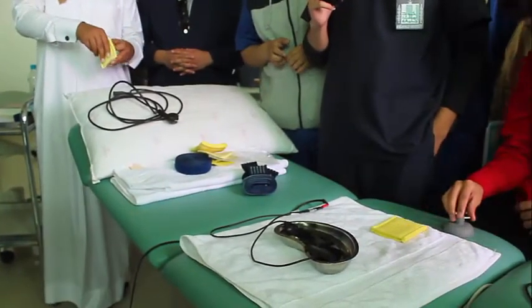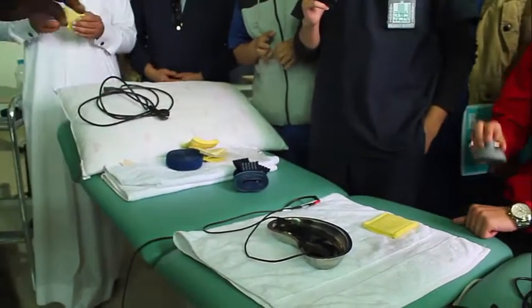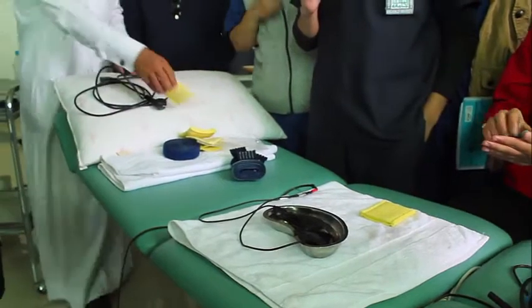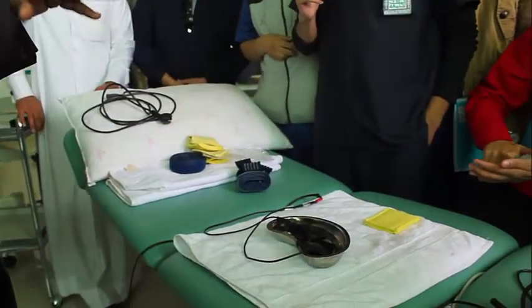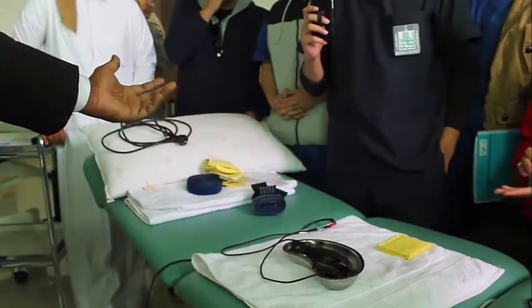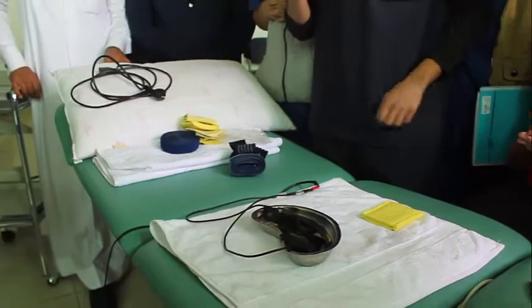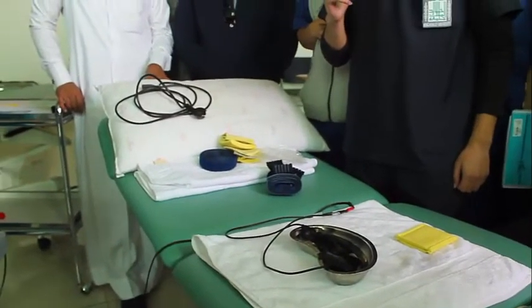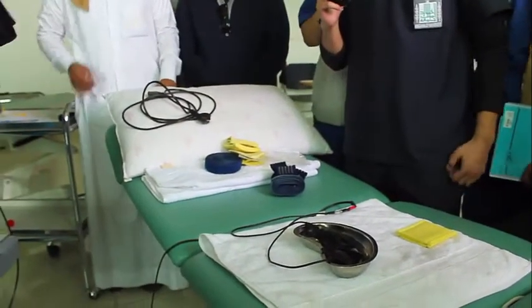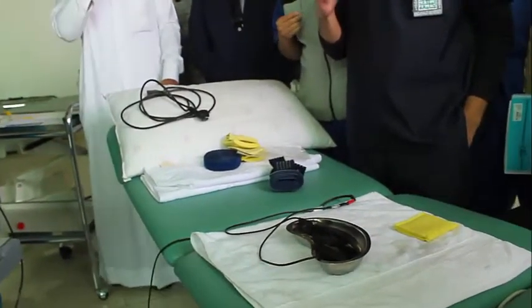Okay. Don't forget to put anode also, because if you don't put anode, how will the circuit complete? Circuit has to complete, no? Yes. So when the electrons are given, they should go back to the anode. Both will be kept, but cathode will be kept on the area of stimulation. For example, you want to stimulate biceps muscle. Which will you keep here, anode or cathode? Cathode. So you have to keep cathode here, anode on the other, adjacent area. That's why you should know which is cathode and which is anode. There are some machines where you have to use anode differently. I will tell that when it comes to each machine.